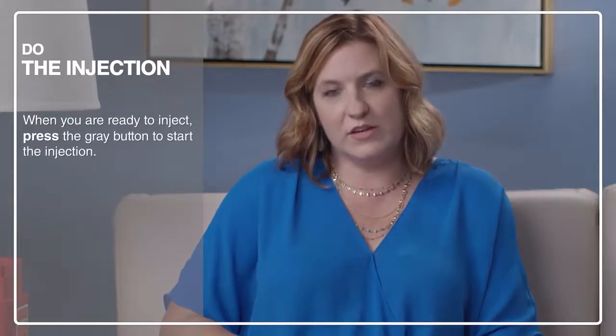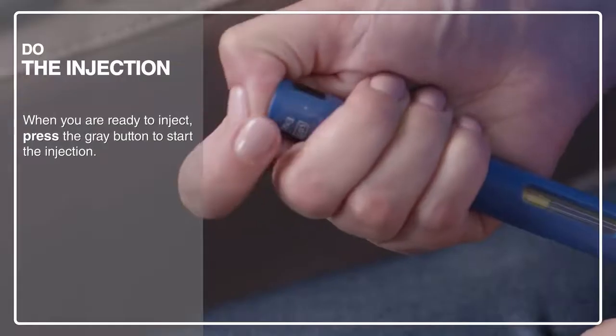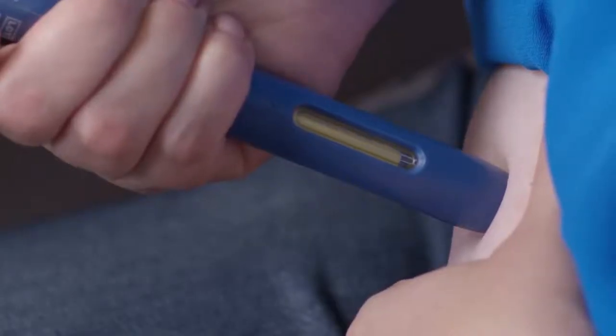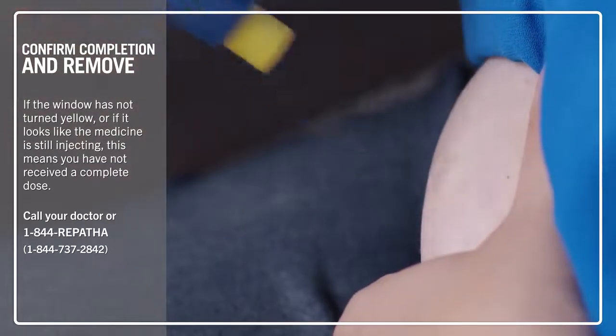When you're ready, press the gray button. You're going to hear a click. You may hear a second click, or you can count to 15, but the best way to know that the injection is complete is to watch the yellow window. Once the window is completely yellow, you can remove the auto-injector from your skin.